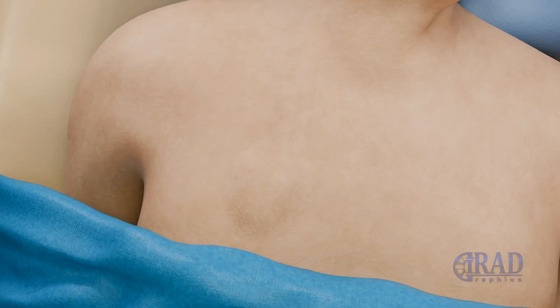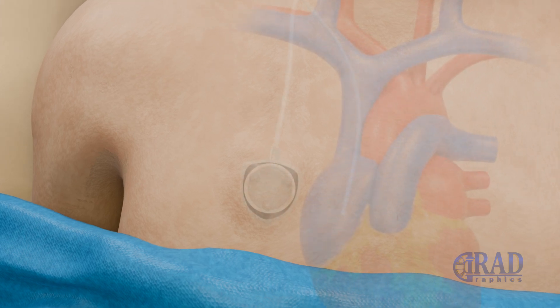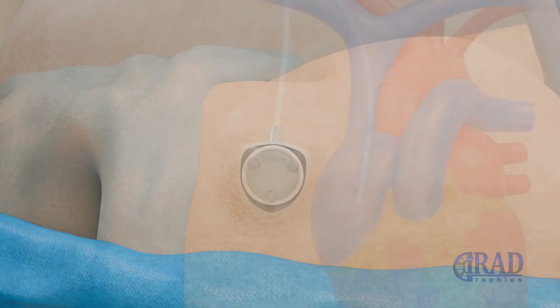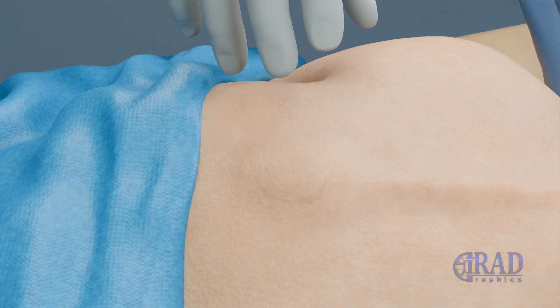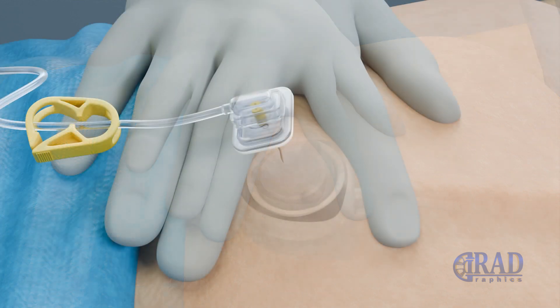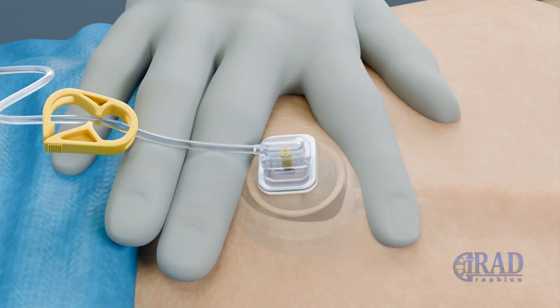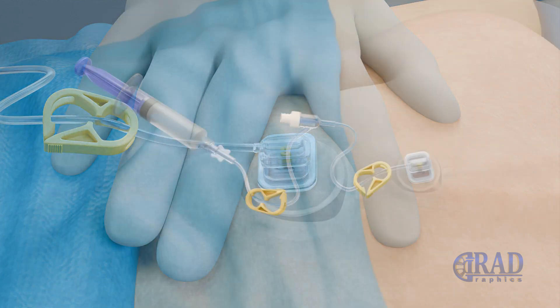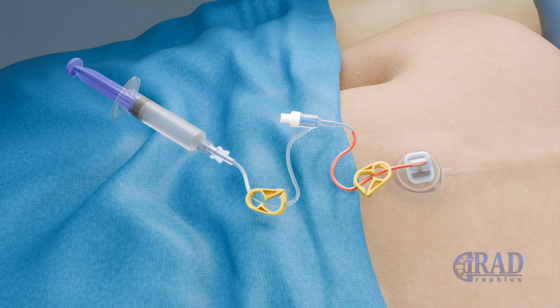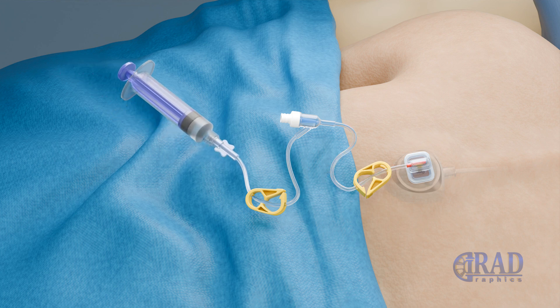A chest port, also known as a port-a-cath, is a small medical device implanted beneath the skin to provide long-term venous access for chemotherapy, blood draws, and IV medications. This animation will guide you through the key steps of the placement procedure using interventional radiology.